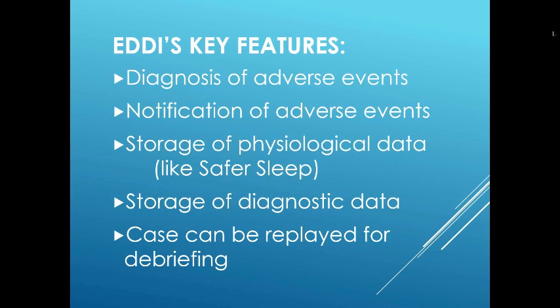Most of EDDI's algorithms deal with changes in variables, not their absolute values. When the possibility of an adverse event is detected, the nature of the possible event is announced in plain English or Mandarin and by a time-stamped text message on screen. The data from the monitor is updated every 10 seconds, but if the adverse condition still exists, the notification is not repeated as this is distracting. It will be repeated after 5 minutes if the condition still exists.